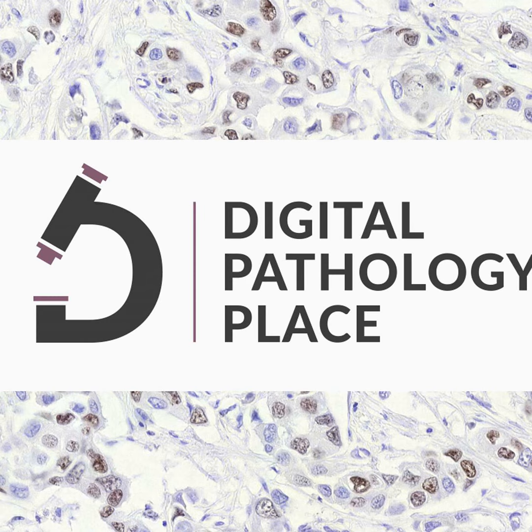First commercialization attempts. Fast forward to 1994, commercialization began to take shape with hardware for a complete analog dynamic robotic telepathology system becoming available for purchase. This marked the transition of telepathology from a concept into a commercial reality, which, by the way, I think is crucial for the advancement of any technology.